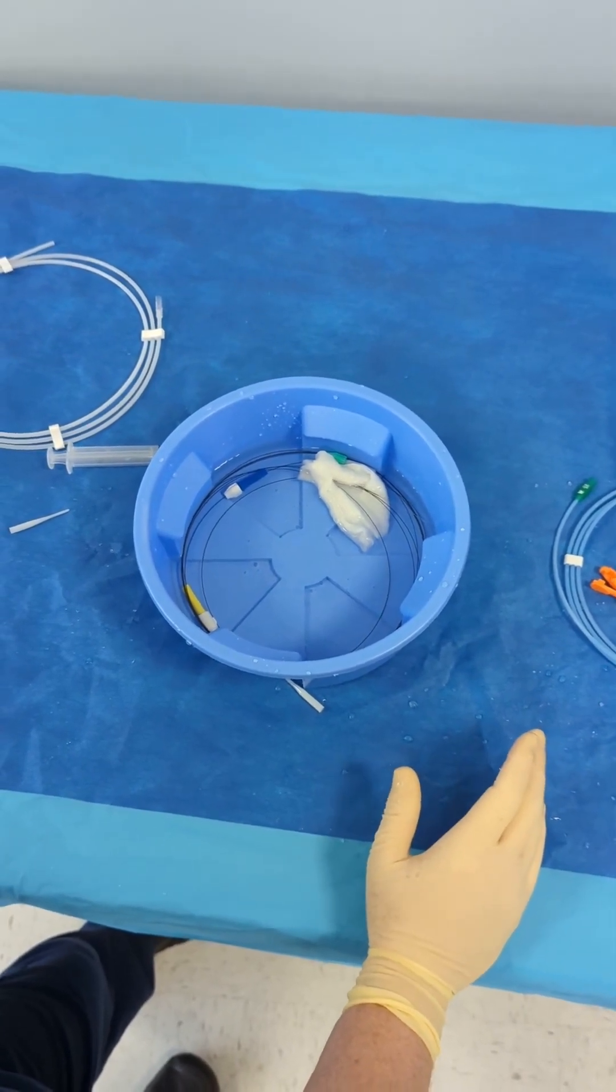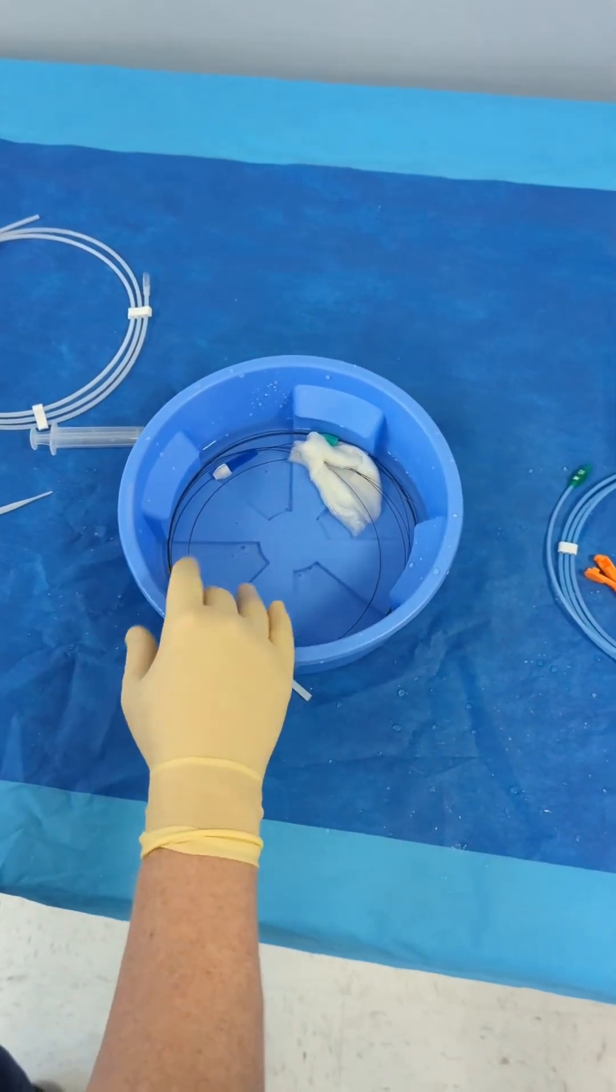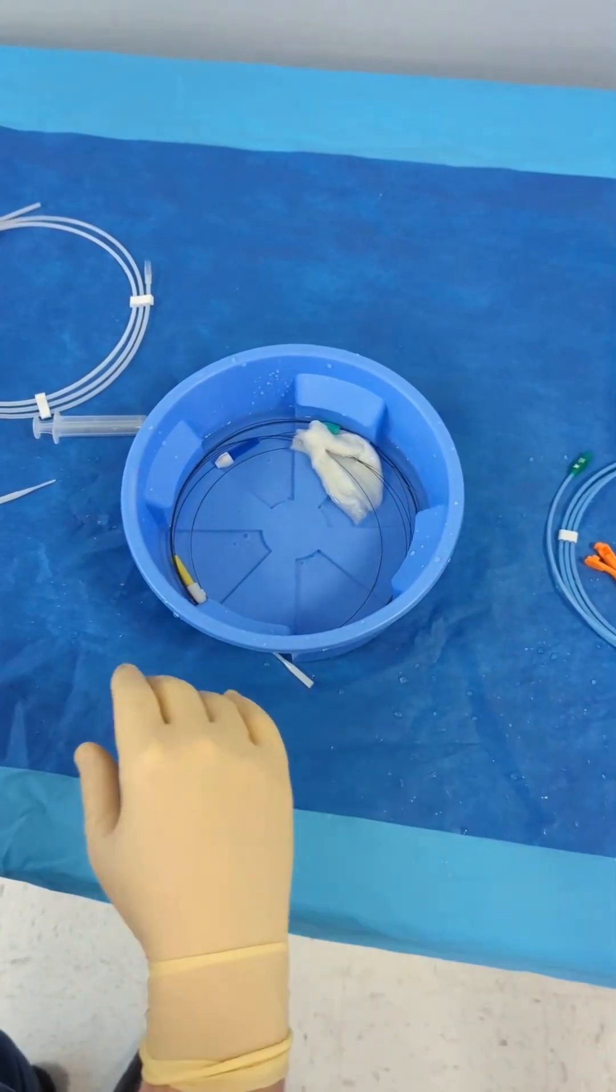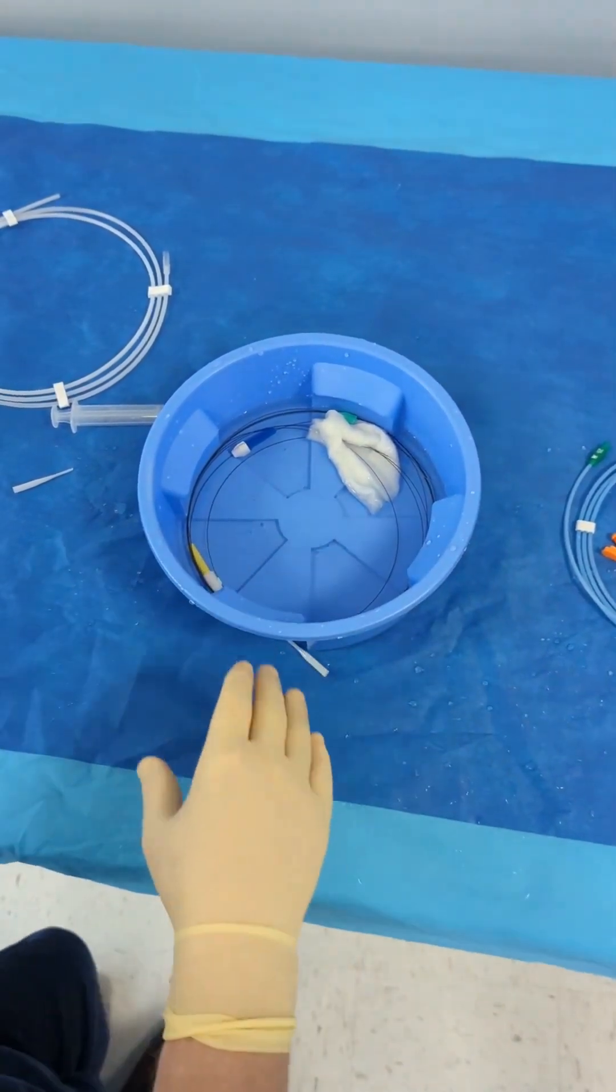So if I take these torques off every time, he and I both have to find where the wire comes out the front of the catheter. And that's why I leave my interventional wires with torques where they are. But I understand if you re-hooped them, that works for you, great. This is why I don't do that.